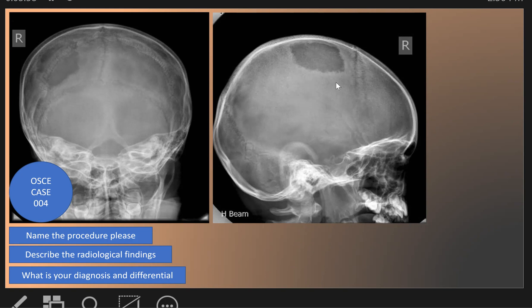If it is a single lesion, it is called eosinophilic granuloma. This case is typical for histiocytosis, and if it is one lesion, it is eosinophilic granuloma.